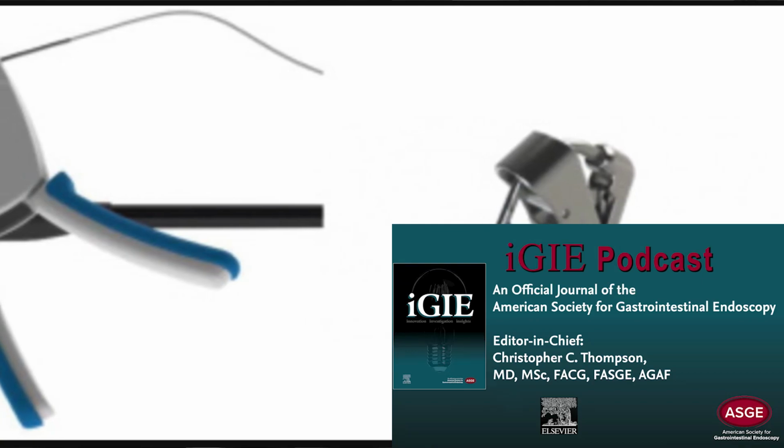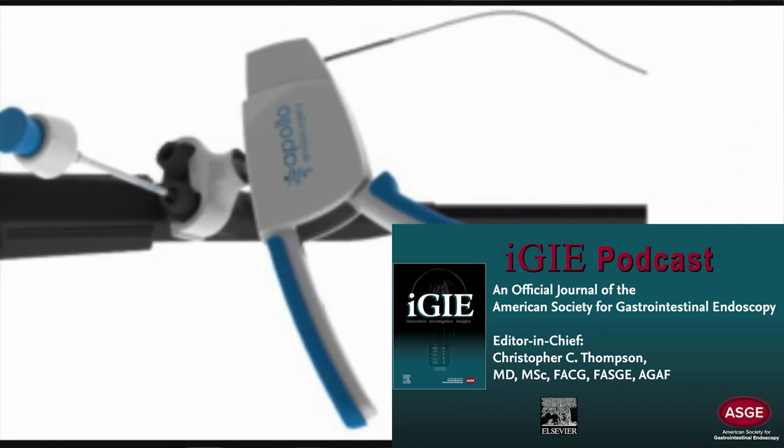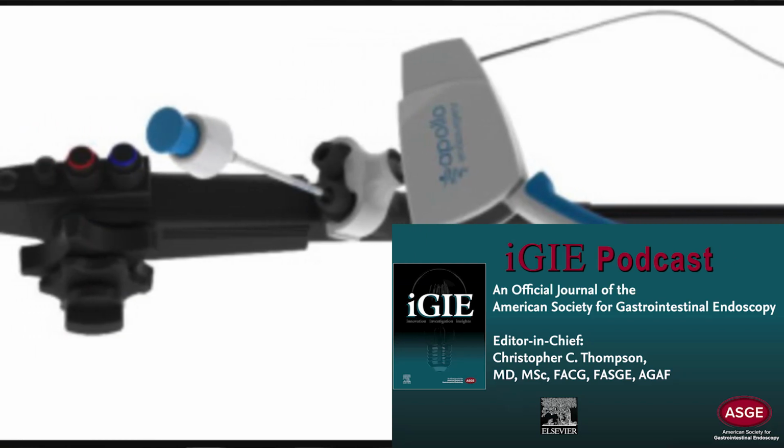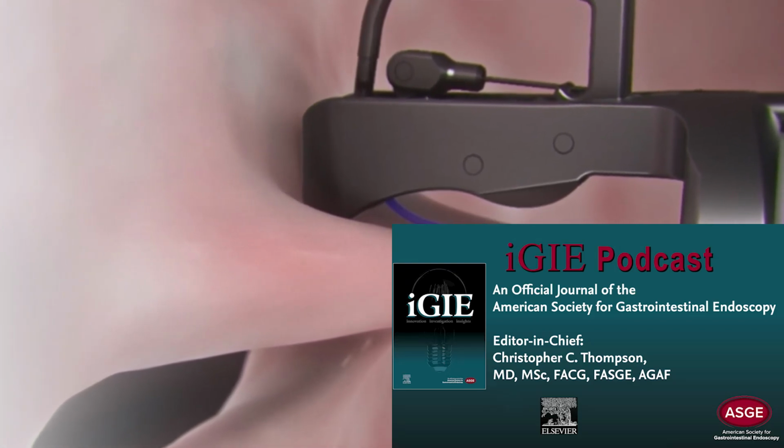And then they got working on the Gen 2 version that was eventually cleared in 2011, and that's the standard dual channel Overstitch that people are familiar with today. So you can see a 10 to 15 year timeline of the work, even just to get to, and we've been innovating since then, but just to get the first usable device to market.